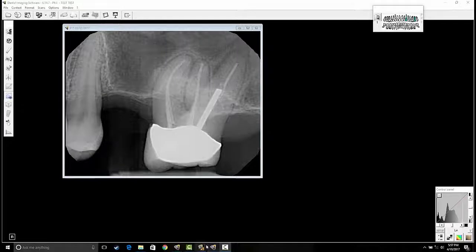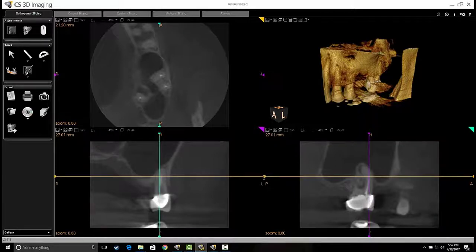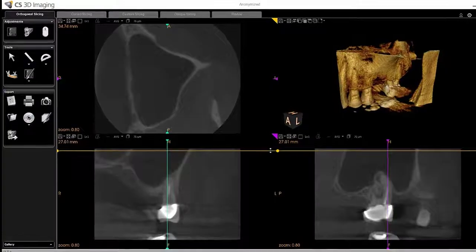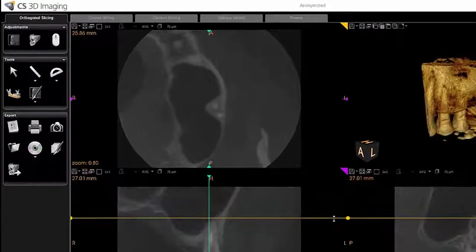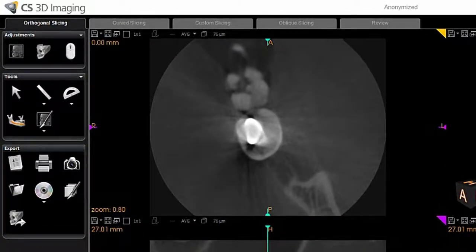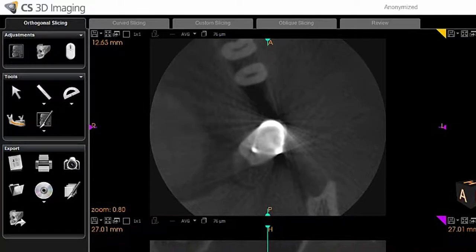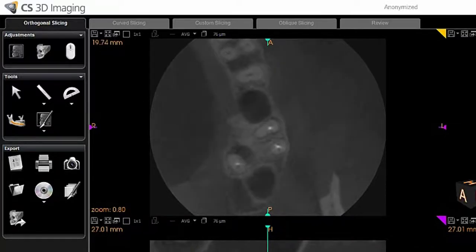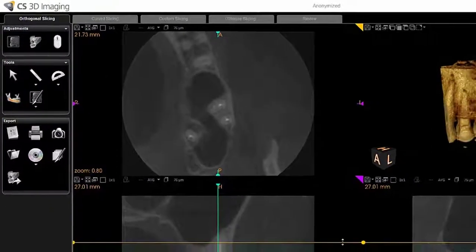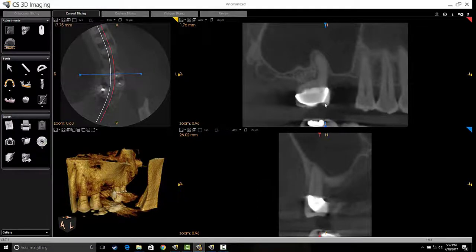I decided to take a cone beam CT scan, and I always like to start by checking the orthogonal slice, because it allows me to review the volume globally — from the top of the volume all the way down, looking at the sinuses and coming down to the bottom, picking up any incidental findings. Once I'm satisfied there, I move to curved slicing to get a global view in panoramic mode.